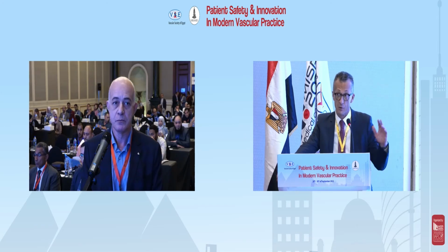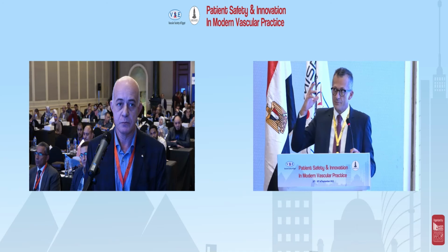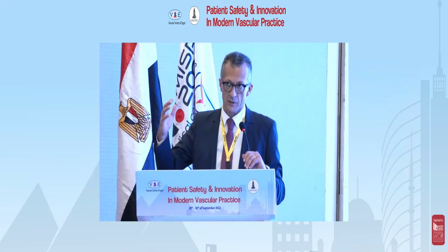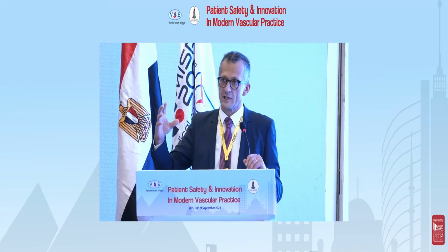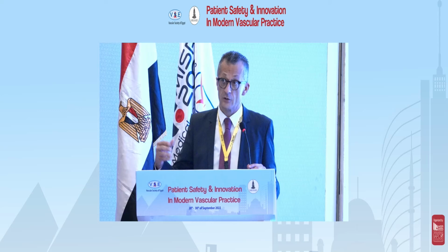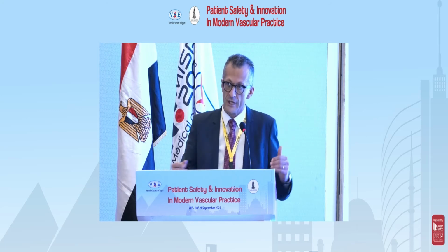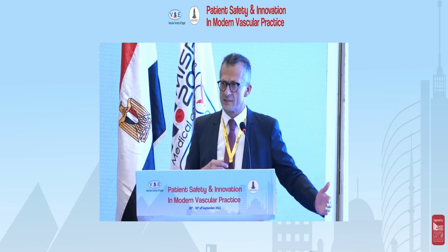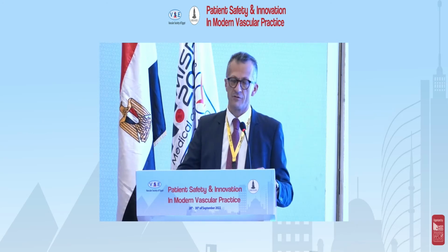in 85% of cases, the idea of use of Rotarex in this patient is, like in native arteries, to remove the thrombotic material, to open a new channel, and to try to understand the reason of the occlusion, and to try to fix this reason. Then in 85% of patients we place a stent to correct a kink or something like this.